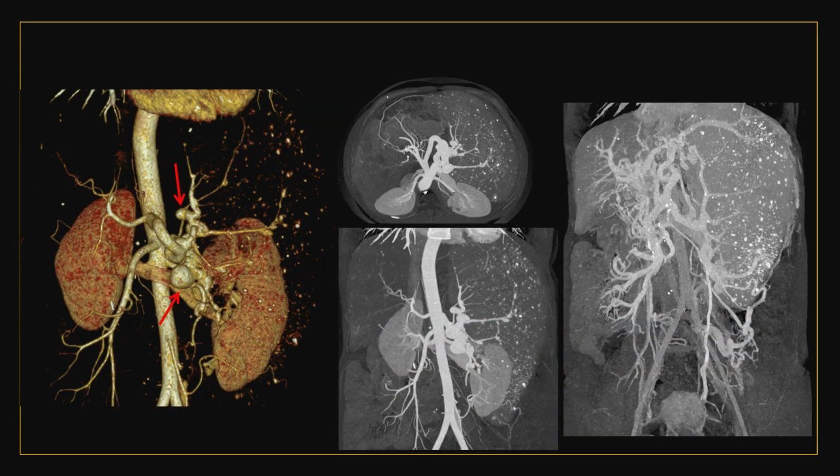What else do we want to know when these patients are being planned for surgery? Because they will have huge splenomegaly, you can see marked splenomegaly almost reaching till the left iliac fossa, and all these starry sky calcifications are Gamna-Gandy bodies. We also want to know how many splenic aneurysms are there. So these are all true aneurysms. We want to know whether the surgeon will be able to get a stump for ligation of the splenic artery and what is the length of the remaining stump. So you can see multiple hilar as well as intrasplenic aneurysms and multiple collaterals.